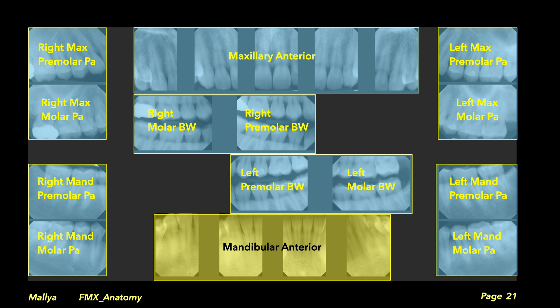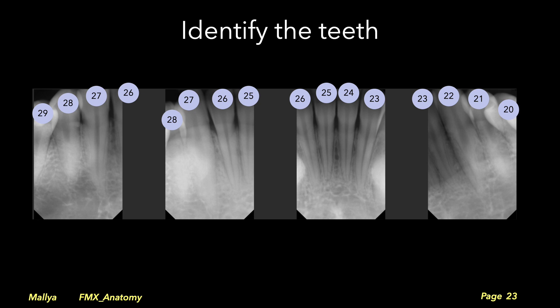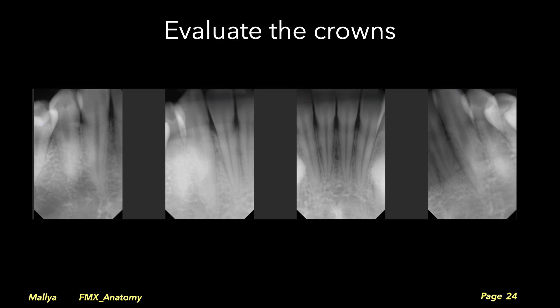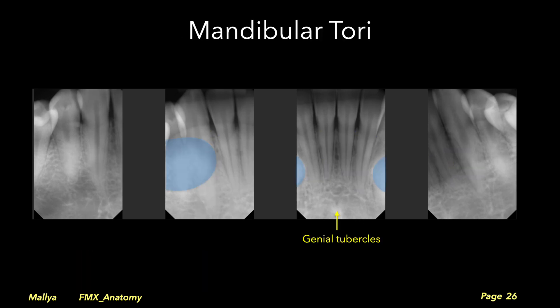We next move on to the mandibular anterior region. These radiographs should show the incisors and canines. Start by systematically identifying the teeth and evaluating the crowns for morphology and caries. Note that in these radiographs the incisal edges of the teeth are not demonstrated; ideally, the radiograph should demonstrate the entire tooth length from the incisal edge to the root apex. Trace the periodontal ligament space and laminar dura around every root. Note that in our patient, there are diffuse radiopacities over the canine and premolar regions bilaterally, representing areas of mandibular tori. This is an anatomic variation, which can be confirmed with a quick clinical examination.